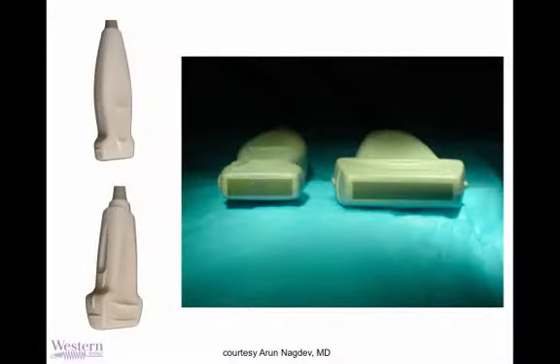do this technique properly. Now, the equipment you'll need for this procedure, of course, is the machine, but the transducer of choice will be a linear array transducer, or the vascular transducer, as it's commonly called, used for its very, very high frequency and corresponding ability to really depict the needle and the vessel very vividly.